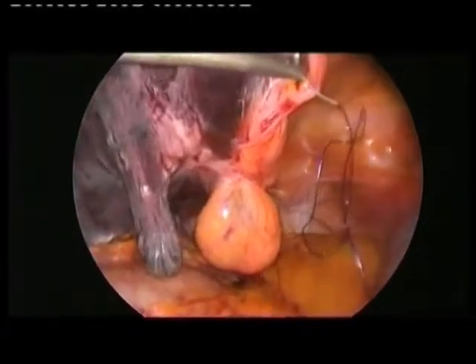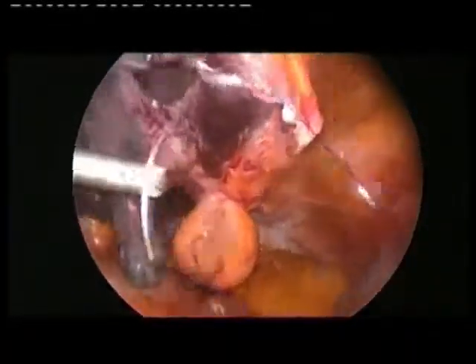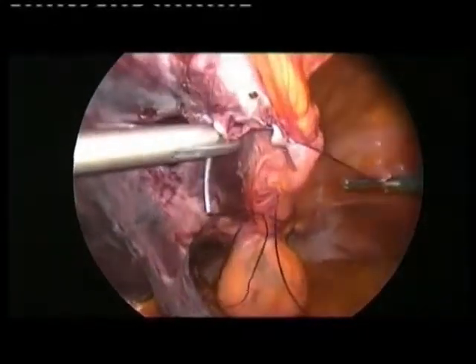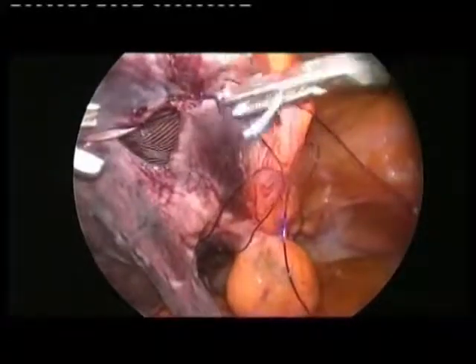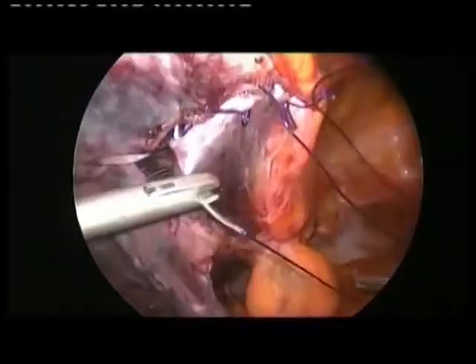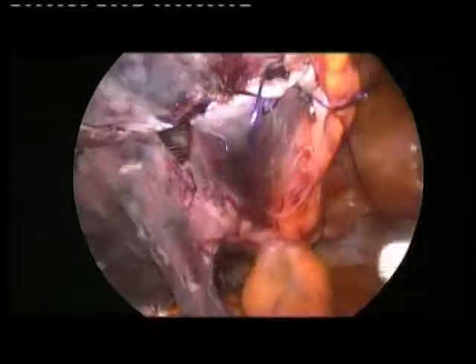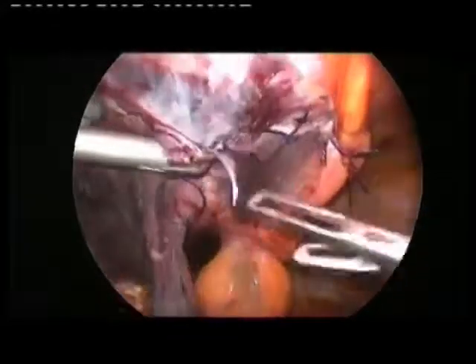Now we do this. Give me a clamp, a clamp to send inside the trocar. We put the Kelly inside the trocar. We follow outside. And then we bring this catheter. And then we introduce the catheter inside the new bladder.